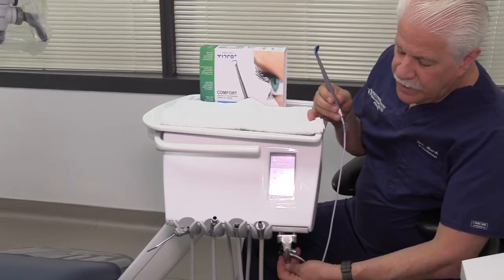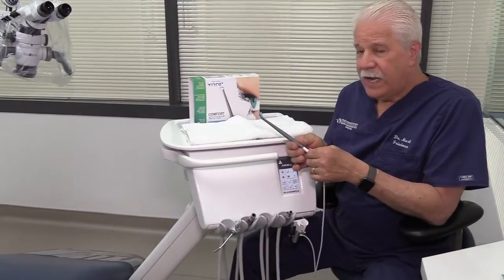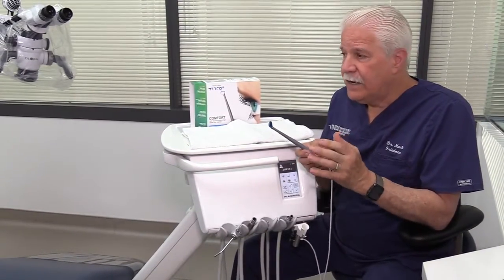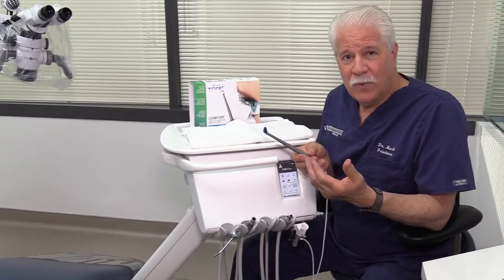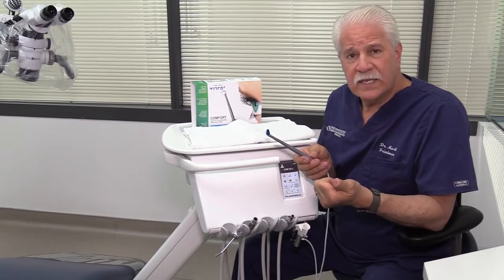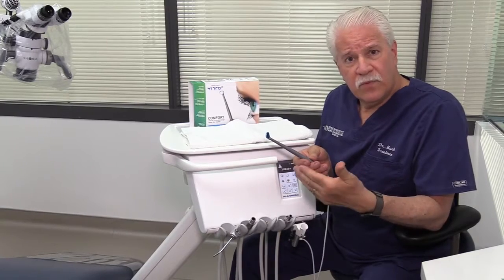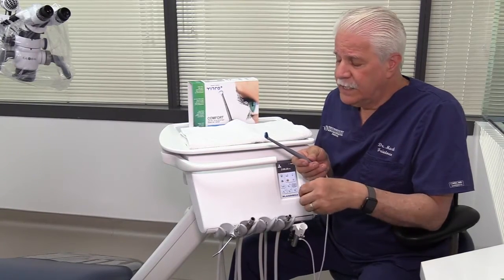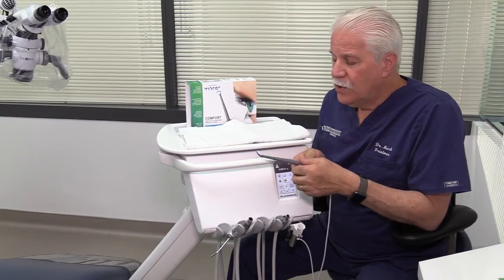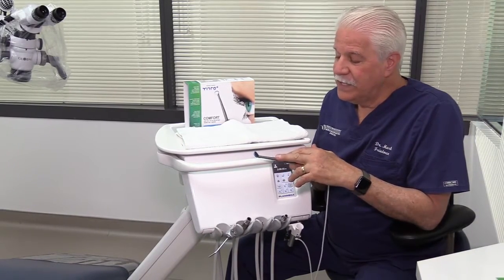One of the important things is to have adequate water when you're working, especially on a vital tooth. Many dentists have a tendency to cut their water down — especially in the US — because they just can't see what they're doing. We know that's counterproductive: it allows the instruments to clog, creating more friction, which is not good for efficiency. More importantly, for a vital tooth, it raises the potential for increasing intrapulpal temperature and possibly causing damage to the pulp and pulp death. So there are huge advantages to being able to see when you're working underwater, which is basically what this system enables.